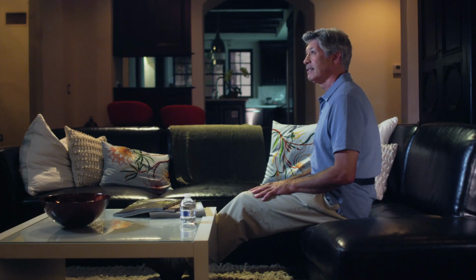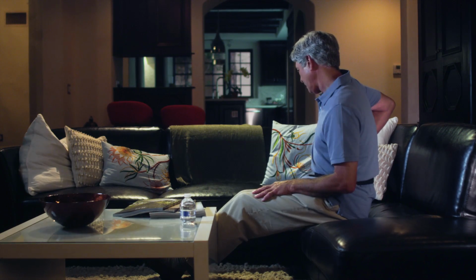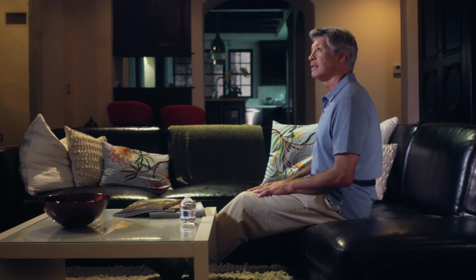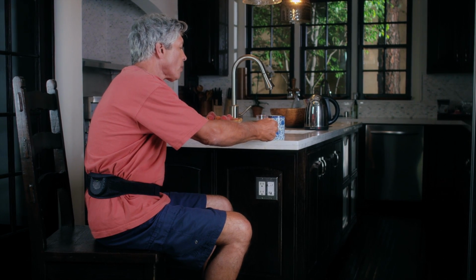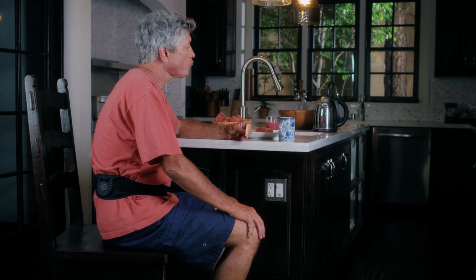Many patients make charging part of their routine. Some patients choose to start their charging session every week while they watch their favorite television show, while others might opt to charge while reading the morning paper. Charging works best when patients make it a normal part of their life. Pick the routine that works best for you and allows you to be sure that your stimulator is charged regularly.